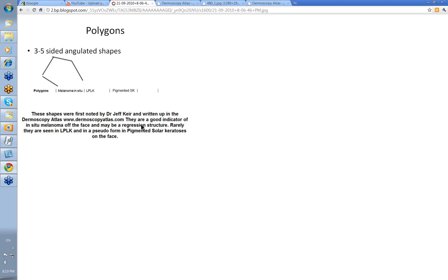Jeff comments that they're a good indicator of in situ melanoma off the face, or lentiginous melanoma off the face, and may also be a regression structure.